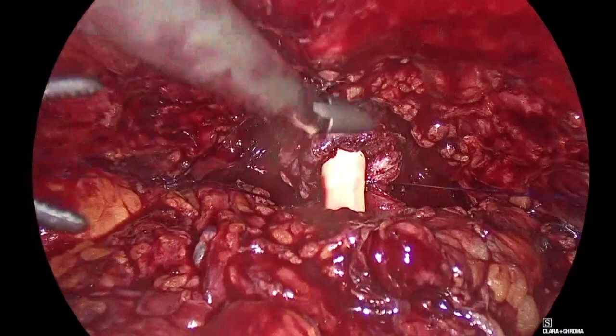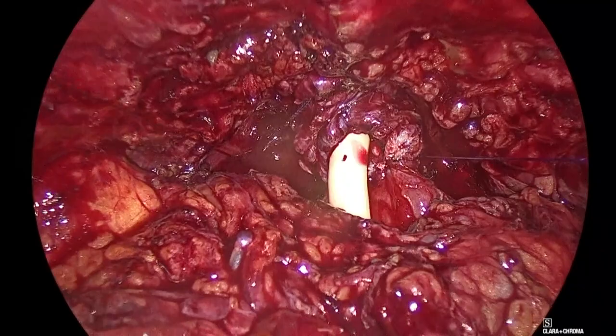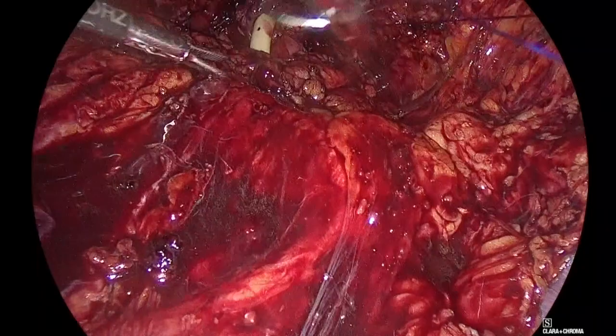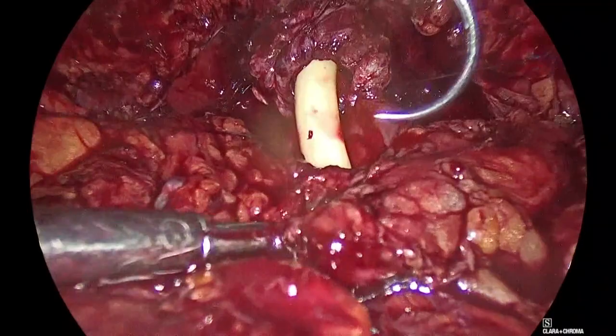So if this goes in straight, the posterior plate goes in straight. Good, stop. A bit further back. There. Good. Needle. Then it means that your anastomosis is perfect, will be watertight. If your catheter doesn't go in at this point, it means that you probably did a mistake at the posterior layer. Padeli, you're not straight. There. Good.